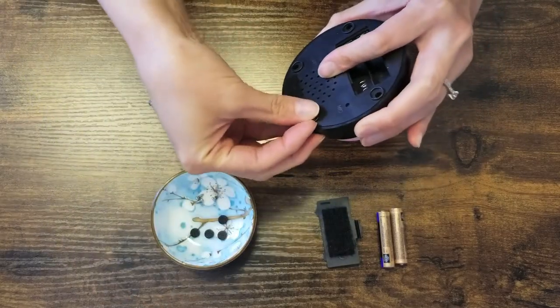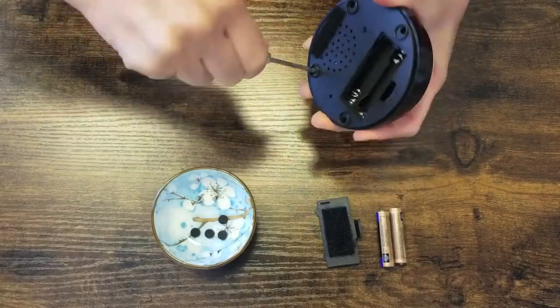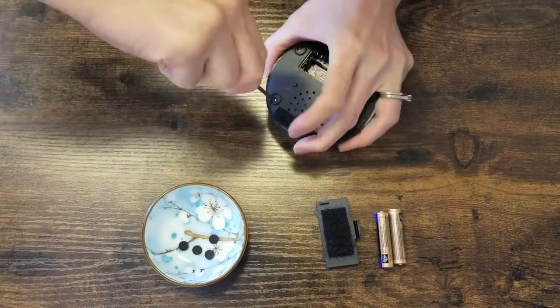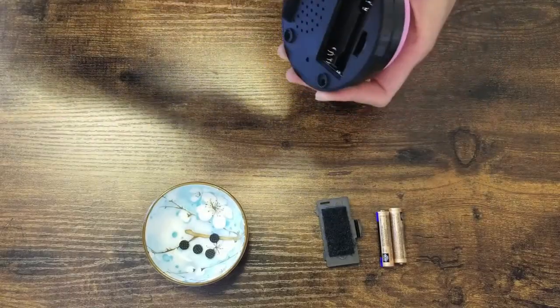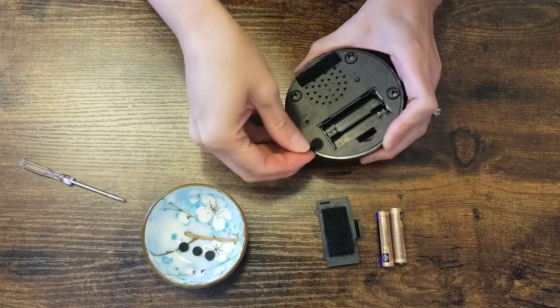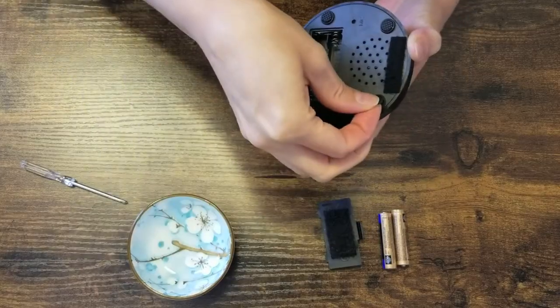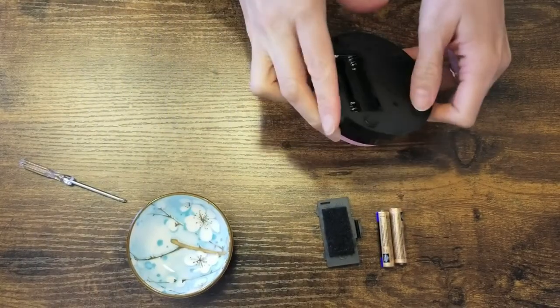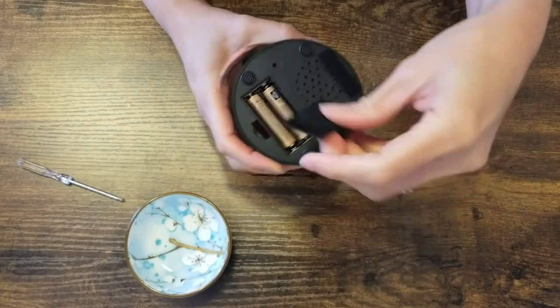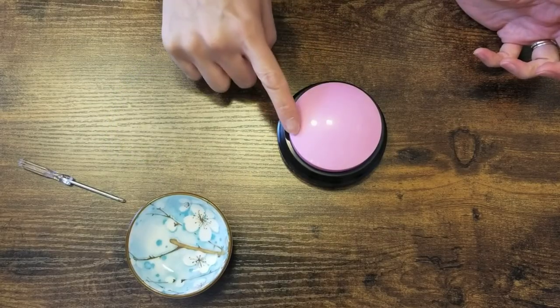Then it's as simple as just putting it all back together. Trying not to strip the screws — they are small screws, sometimes it's hard to get a good grip on them. Put the little feet back on. Much easier. Significantly easier to push.